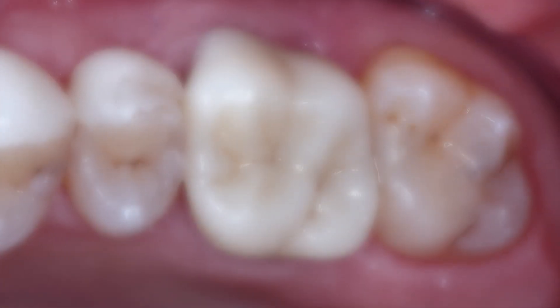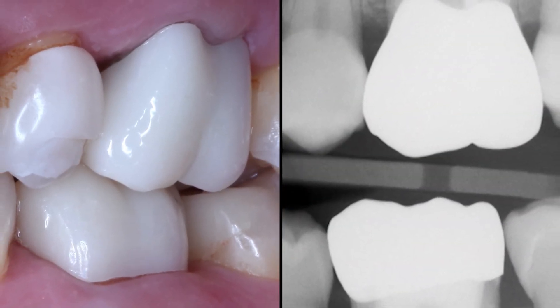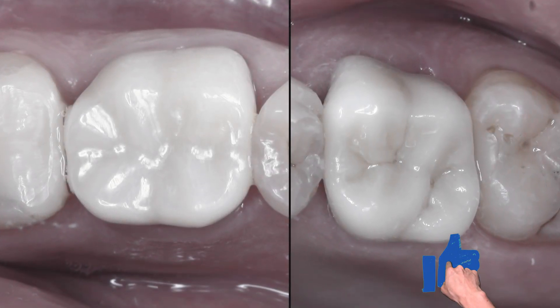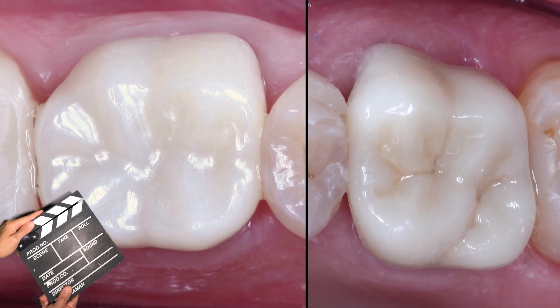We were able to address the patient's concern by efficiently delivering very strong and aesthetic Bruxer Now crowns. Each restoration took 40 minutes to mill. Both crowns were milled using an A1 block, but if additional characterization is desired, you can see the difference the 10-minute optional oven cycle can provide these restorations.